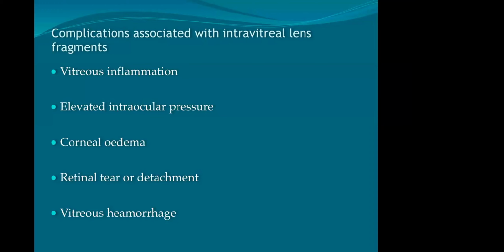But remember, if the lens fragment is hard and small, chances of giving trouble is less. If the lens fragment is bigger, again, the chances of giving more problems are more. And the soft lens matter causes more problems. So I thought that small hard lens matter will not give me trouble.